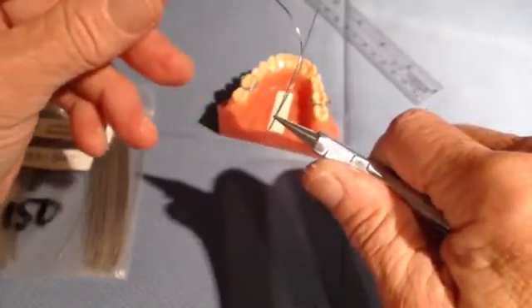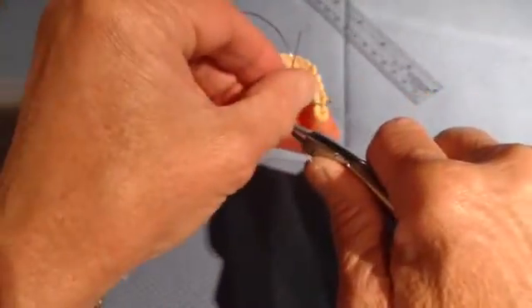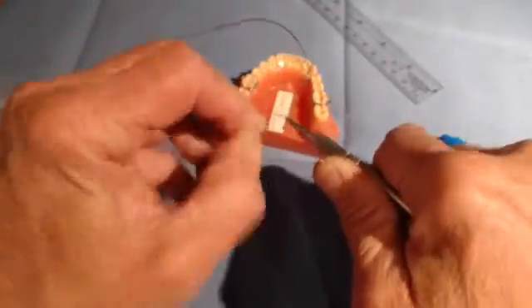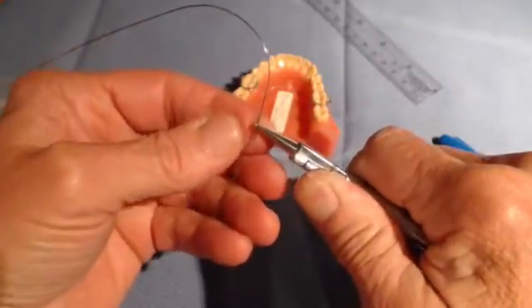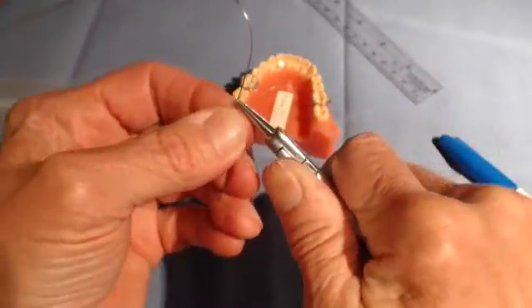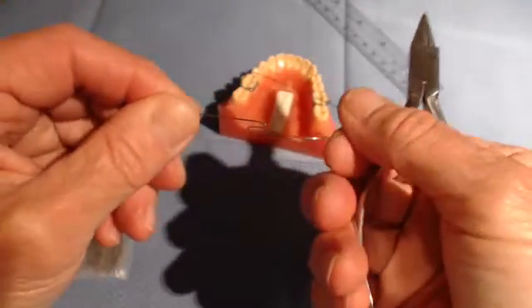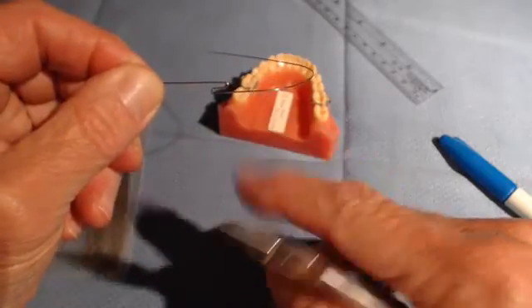Same wire bending principles apply: perpendicular, parallel, hold tightly, roll this back over the top until the distal and the mesial aspects are parallel. By parallel, I mean those two ends — distal and mesial — are paralleled.